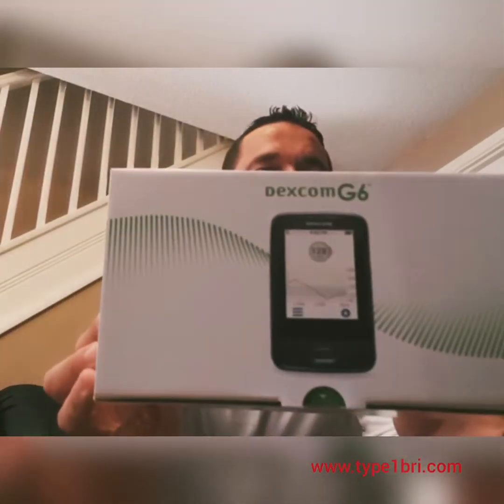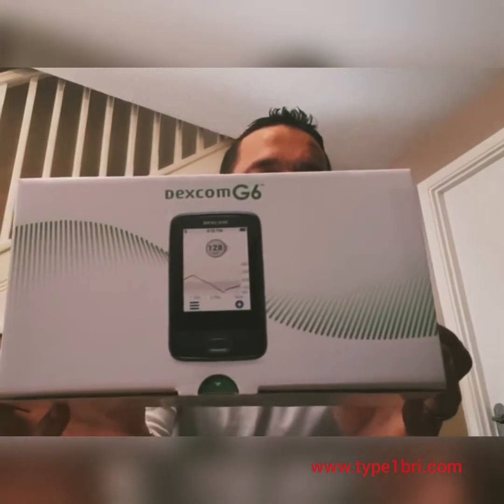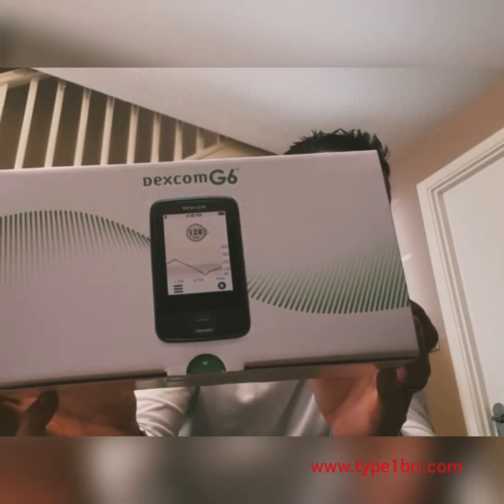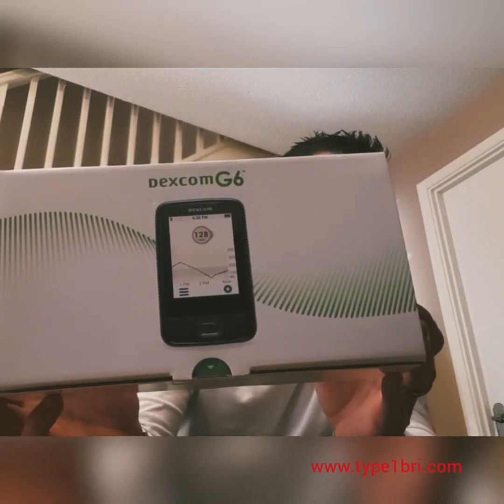Finally, I'm lucky enough that Dexcom also sent me the receiver, which in the past being self-funded is something I've never bothered to actually buy. So I'll be interested to give this a go and see how it works. I'll be using the app on the phone mainly because I have my phone with me all the time.